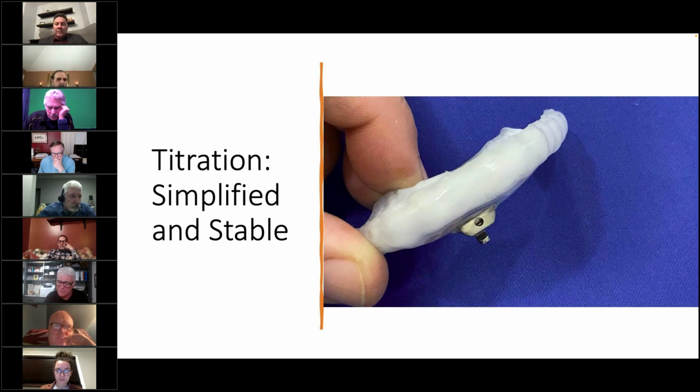Now, let me make it very clear. This in no way, shape, or form makes the appliance more effective. It's not like, therefore it's better. No, it's no better as a result of it. It's just more stable and easier for patients to adjust and for you to adjust and to know where a patient is.